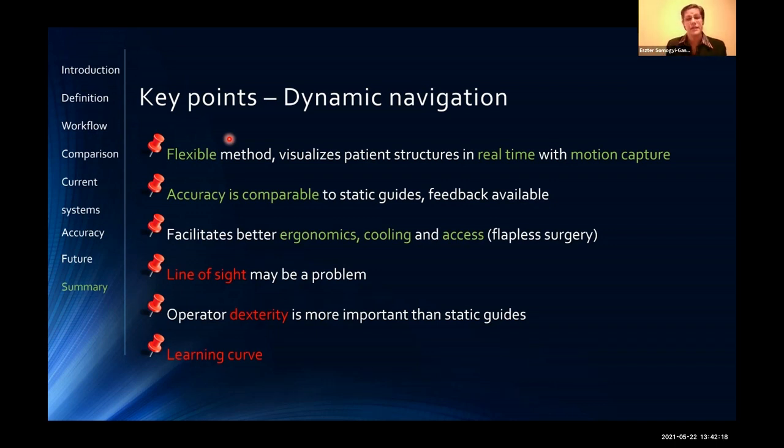It is definitely a flexible method, and you can actually follow your drilling in real time with some kind of markers, motion capture on the patient's CBCT, so you can see how your drill moves in the bone, which I think is pretty cool. The accuracy is very comparable to static guides, and there's a feedback loop, so you can always double check if you're accurate enough. It's reasonable ergonomics. You know, you are looking at a screen, you don't have to crouch too much. One can cool, and there is good access to the surgical site. It also theoretically supports flapless surgery.